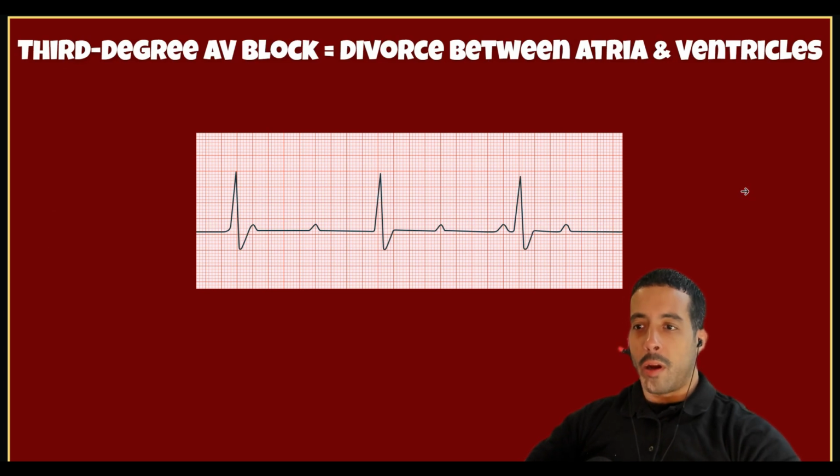So when we think about the third degree heart block, what are we seeing? Think about it. Remember, we said 6 boxes is already bradycardia. Think about the amount of boxes that you see here.